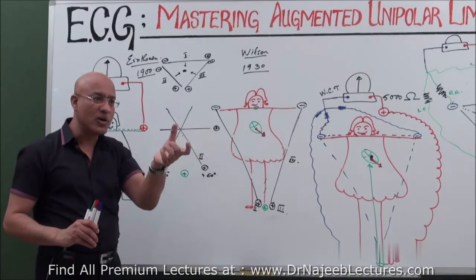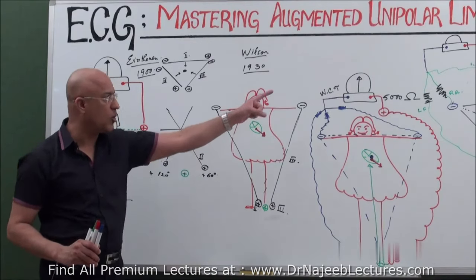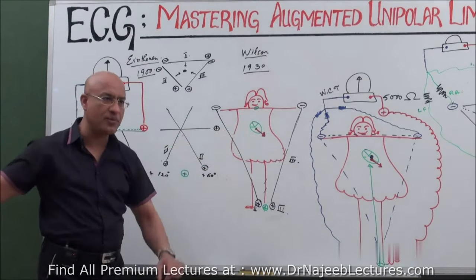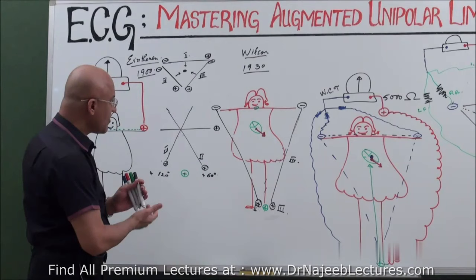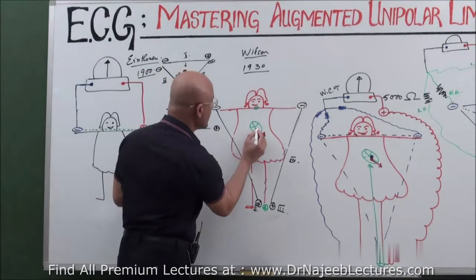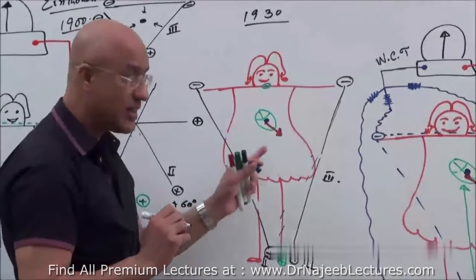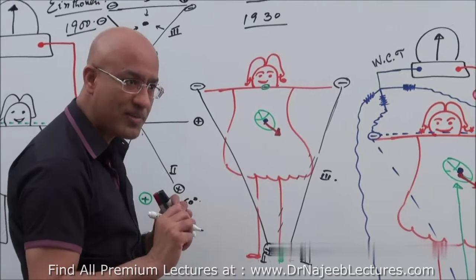Exploring electrode. But he converted the negative terminal into an indifferent terminal. You know how? By connecting the negative terminal to the right arm, left arm and the foot. Any question up to this? Then the virtual terminal came in the center here. This was your virtual terminal, the indifferent terminal. The indifferent terminal is here for functionality purpose.